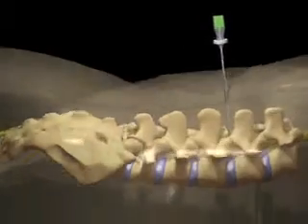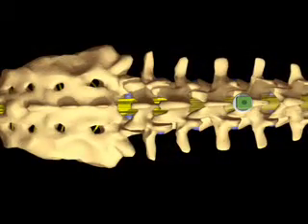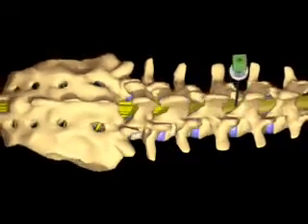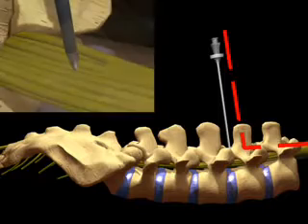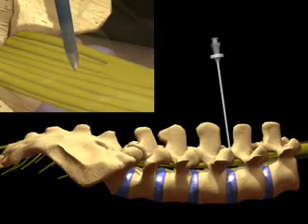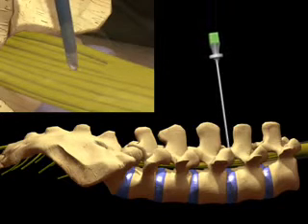The needle passes between the spinous processes with the needle nearly perpendicular to the spinal canal. Because of the needle angle, the catheter must take a sharp bend as it exits the needle into the intrathecal space. This sharp bend can make advancement of the catheter difficult and in some cases requires the implanting physician to make repeated needle punctures to advance the catheter. This creates multiple dural holes, increasing the likelihood of cerebrospinal fluid leakage.